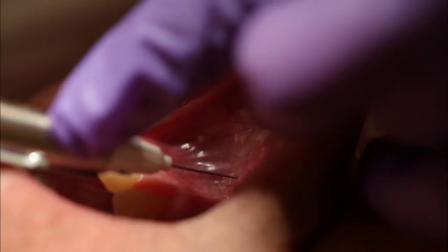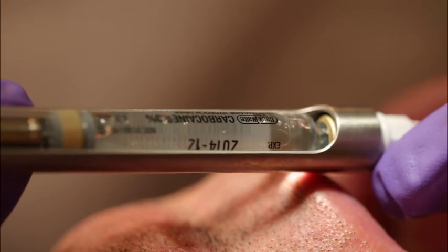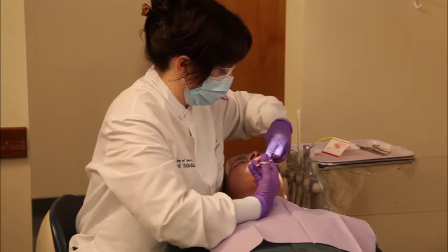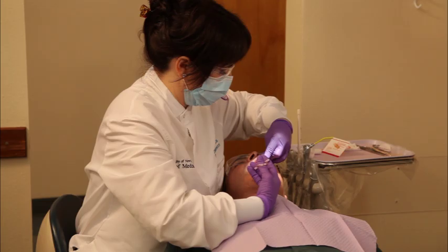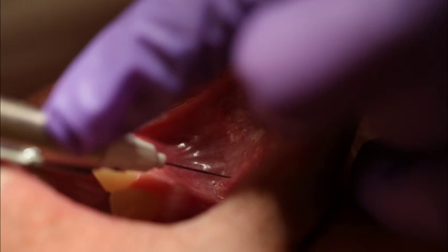Aspirate by pulling the thumb ring back gently 1 to 2 millimeters at the injection site to prevent the possibility of an intravascular injection. If a negative aspiration is achieved, slowly deposit approximately 0.6 milliliters of solution, 1/3 of the cartridge, over approximately 30 to 60 seconds. If the tissue balloons, you are injecting too rapidly.